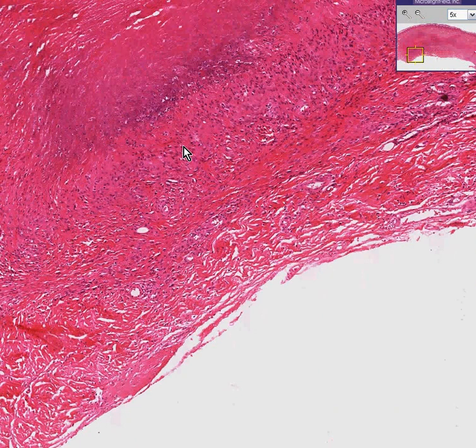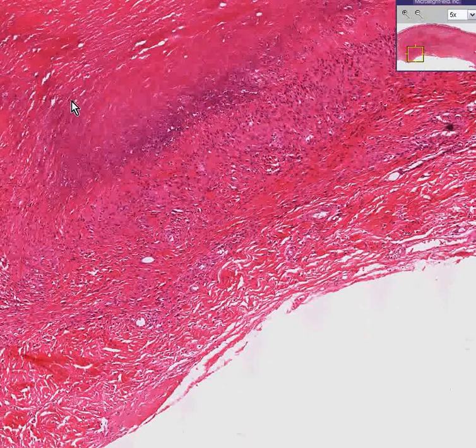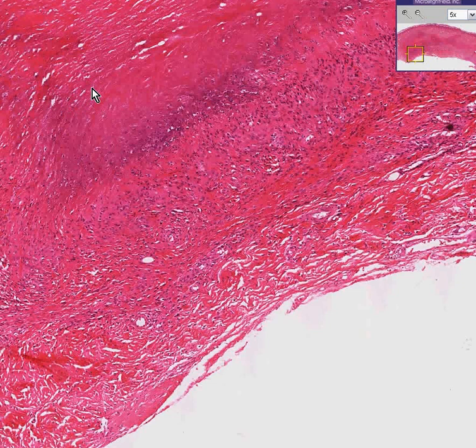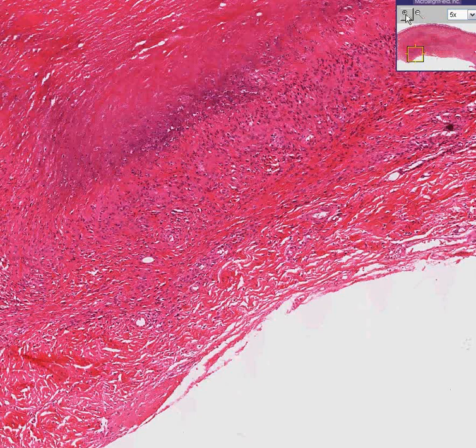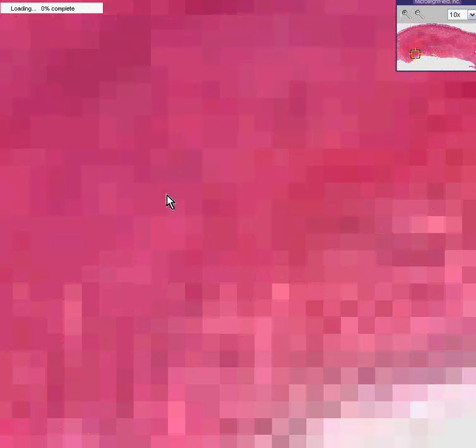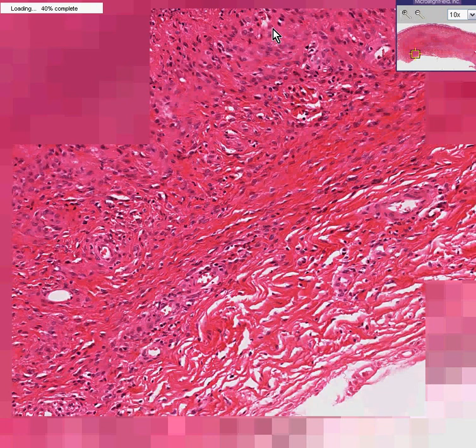And once again, it's a centrally necrotic, fibrinoid type of necrosis, rimmed by sort of a palisaded or lined up arrangement of fibroblasts. And it is fairly well delineated.